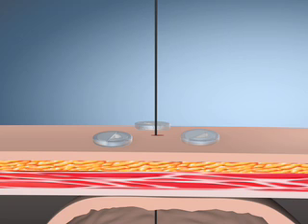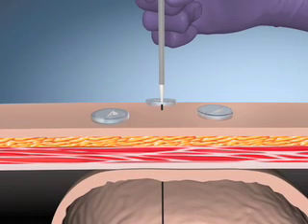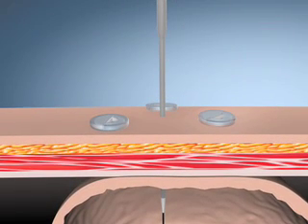Apply water-soluble lubricant at incision site. Advance the serial dilator over the guide wire. Use a firm clockwise-counterclockwise twisting motion to initiate advancement of the dilator sheath into the gastric lumen. Stay perpendicular to the skin while dilating so as not to kink the J guide wire. Fluoroscopically verify placement of the dilator tip into the stomach.